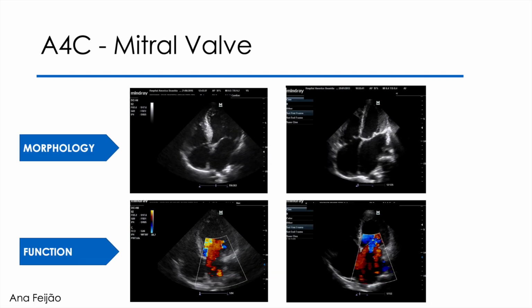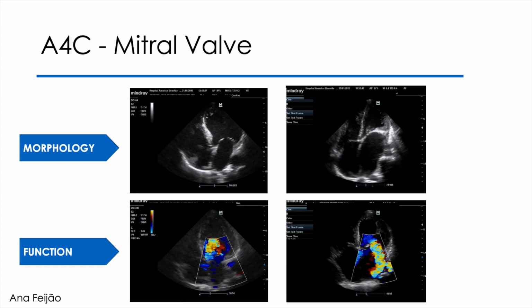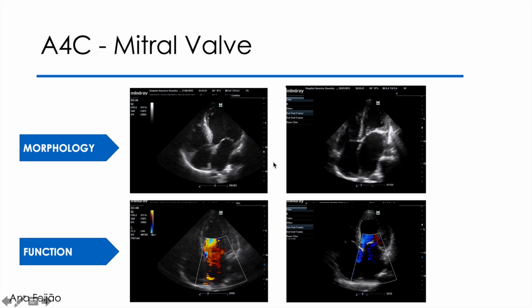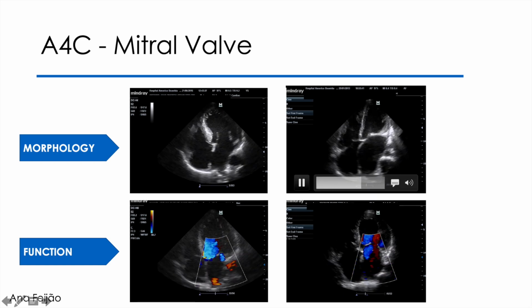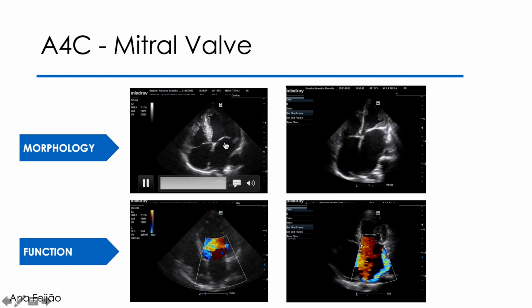Next, I evaluate the mitral valve. I place the focus at the level of the mitral plane and see how the leaflets open. If there is any mass or attached structure or any calcification.